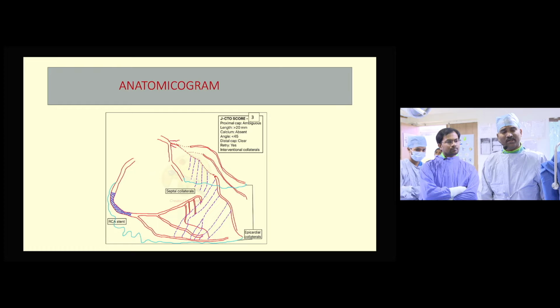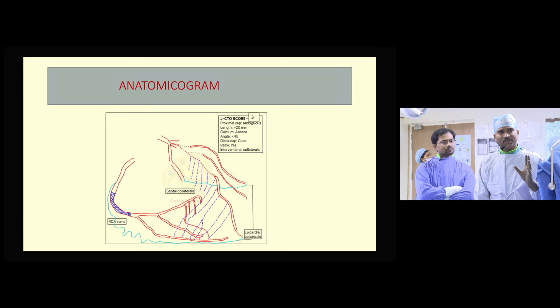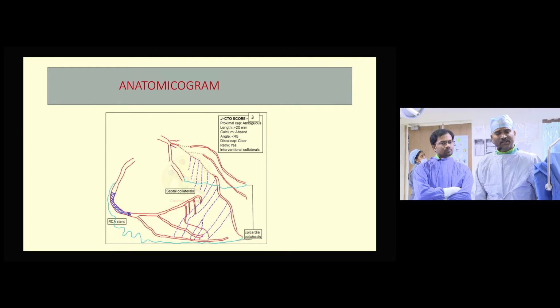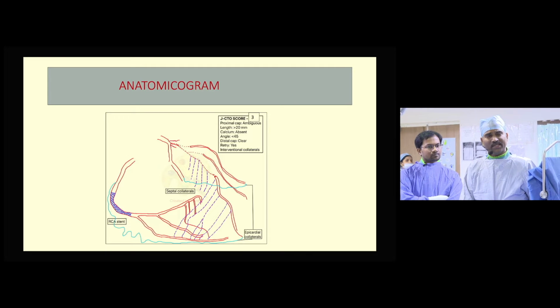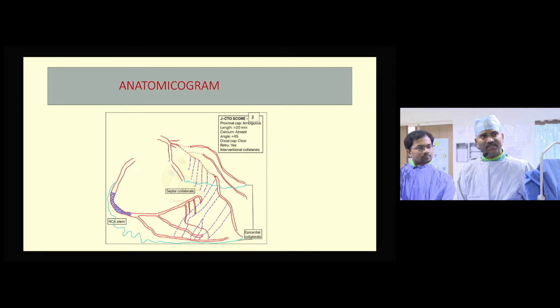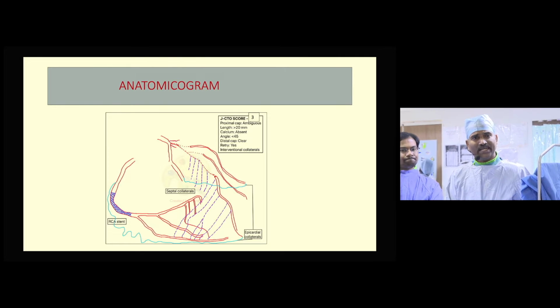So it is quite difficult to understand where the ostium is when we are trying to wire. To wire antegradely in this patient, we need imaging guidance. So my plan is to do an IVUS-guided entry into Ostial LAD, and after that I do wire escalation if I am sure about my course of wire.